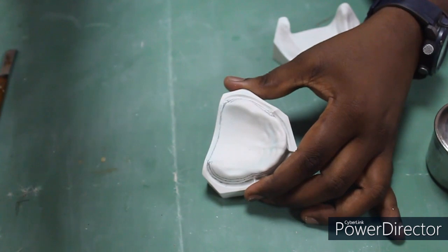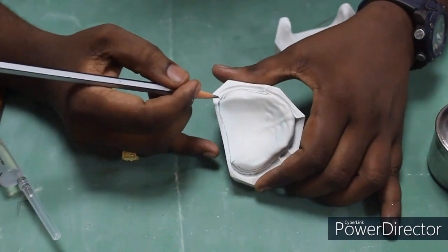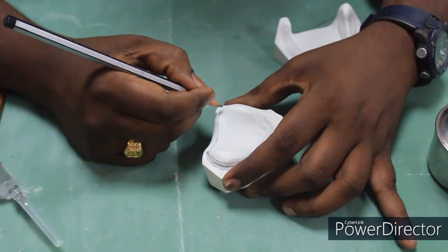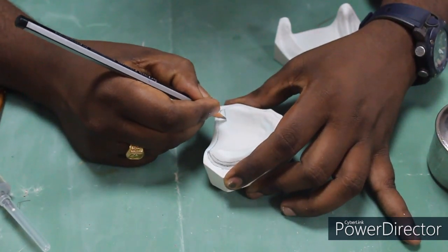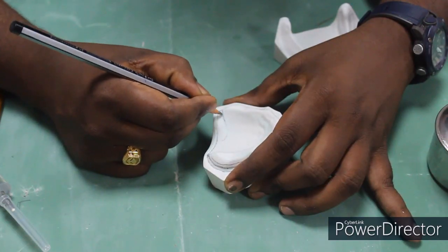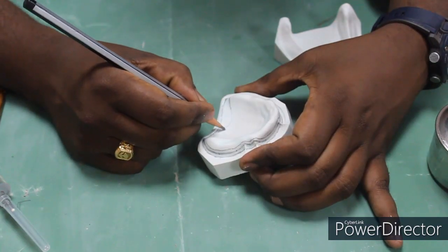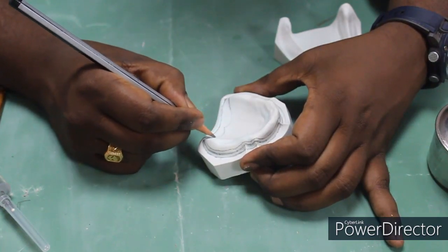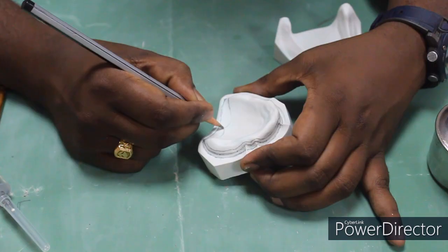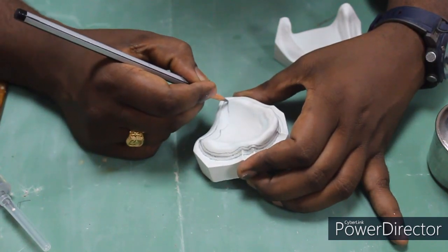So the next line will be the spacer line that has to coincide with the anterior vibrating line, which we are drawing tentatively. Why? Because in this Boucher design he has recommended that we cover the entire denture base area with a spacer, that is a base plate wax of 1 mm thickness, only exposing the posterior vibrating line.